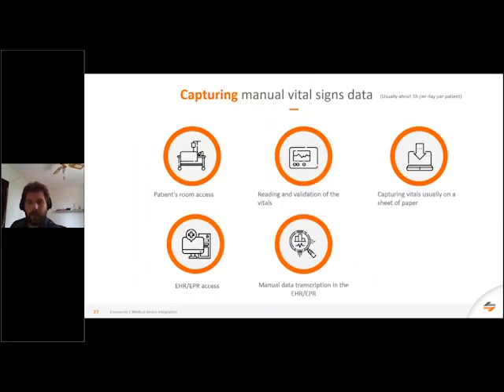Now, let's focus on Sarah's reporting task. Currently, she has many actions to do, concerned with the retrieval of data in the EHR. These operations are time-consuming. First, Sarah accesses the room and performs value care tasks for the patient. Then she reads devices and verifies that everything is okay. Then she writes vitals on the support, like a sheet of paper, and reports them into the EHR.